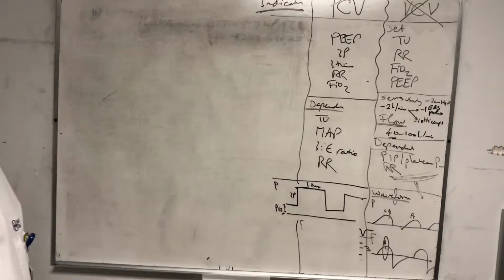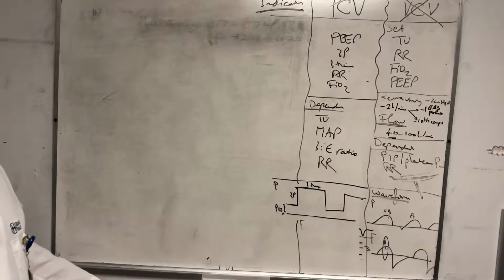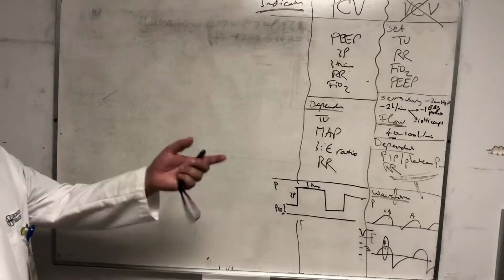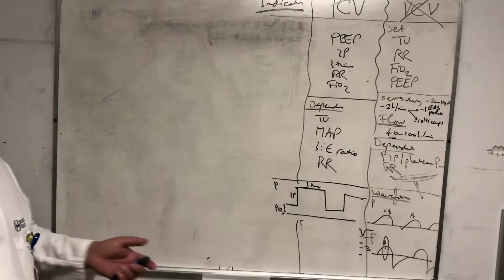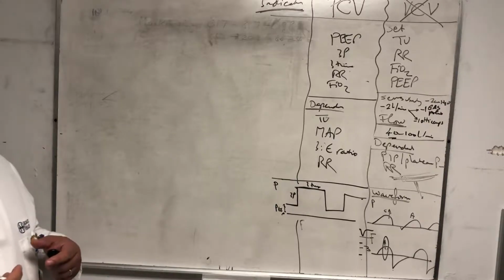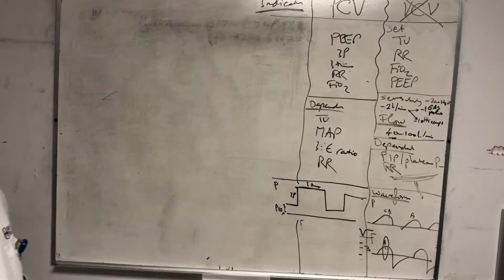It is the first mode of ventilation. Things advanced. I'm sorry that you like the first mode of ventilation, but it's no different than having the medical student do this with the ambu bag. That's exactly what you're doing. So it's the simplest mode of ventilation. You're not using the vent to your advantage. I think we moved generations after this, so I wouldn't use it at all.